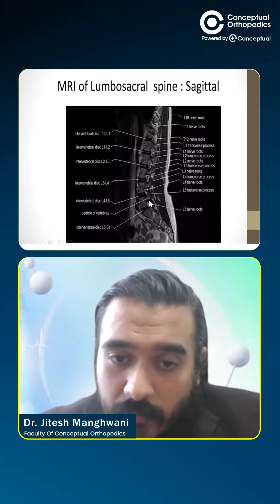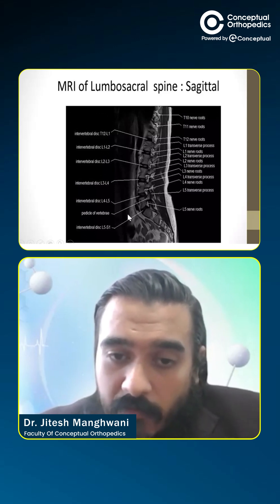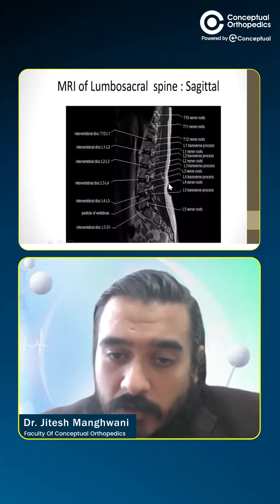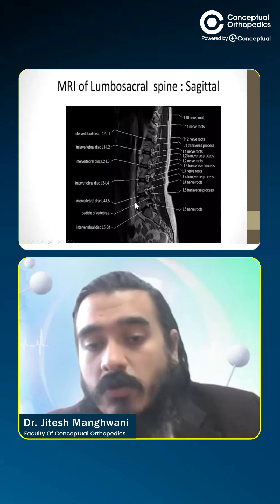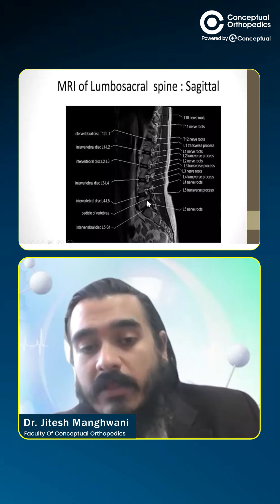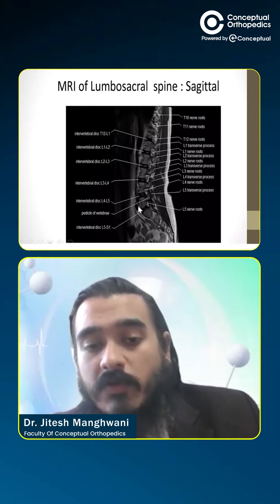This is the pedicle of the vertebra. The posterior elements of the vertebra are joined with the anterior elements via the pedicle.